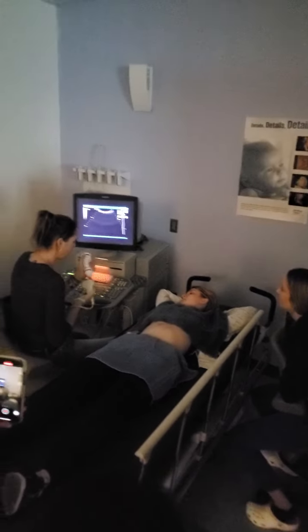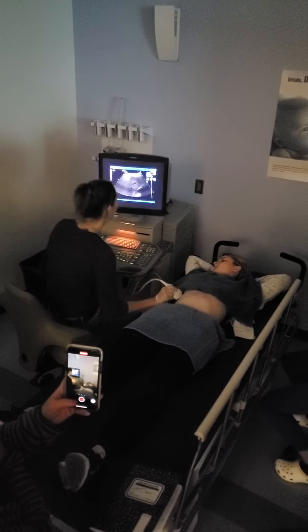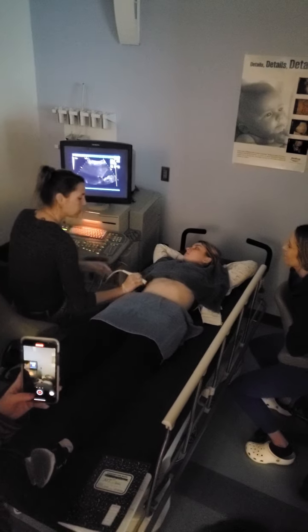All right, so first things first, put your probe down how the ribs run. If I'm just like, hey, I need this, I'm like, what is even going on? I don't know what's going on here. So start with how the ribs run.